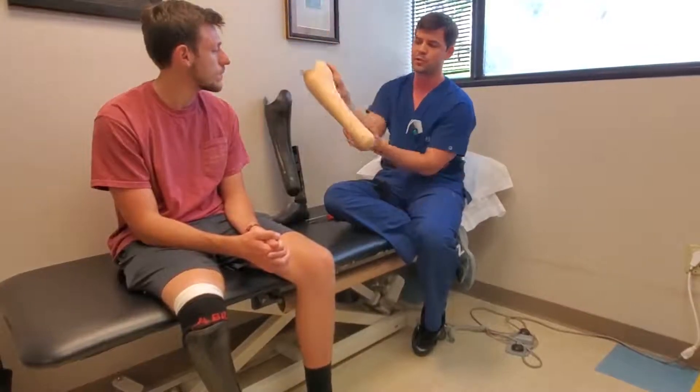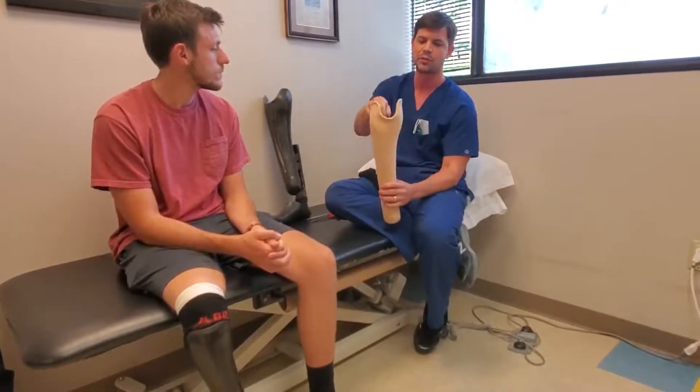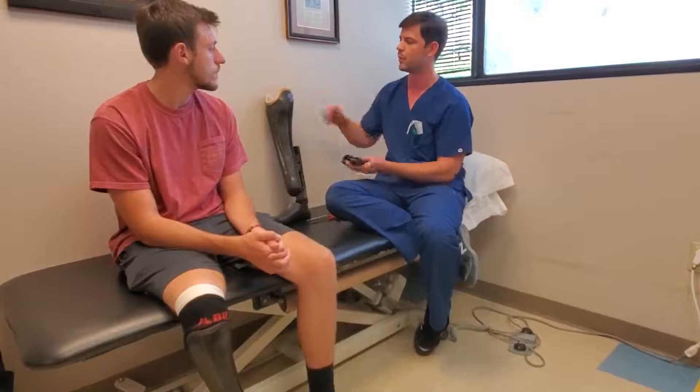He's used to this anatomical skin-fit, one-ply P-light system. Just a P-light liner in a stove pipe design to allow it to expand and then capture the anatomy distally. He wears a sock, puts the P-light on his leg, pushes down into the socket, and it suspends anatomically with a one-to-three ply fit over the P-light.